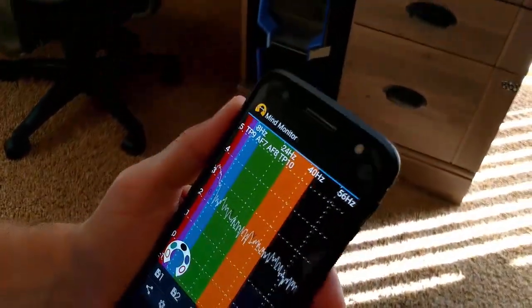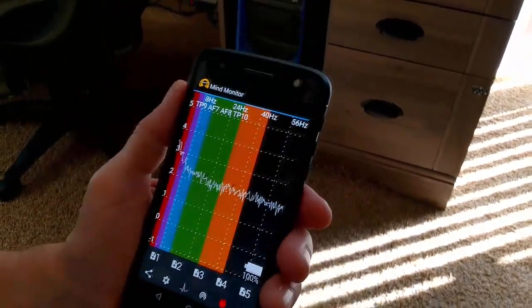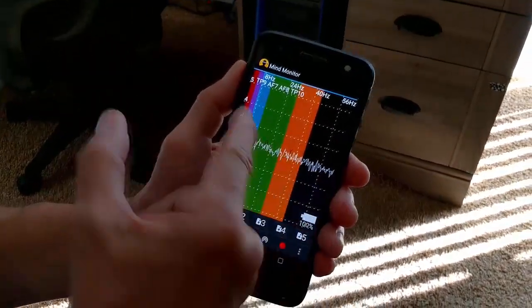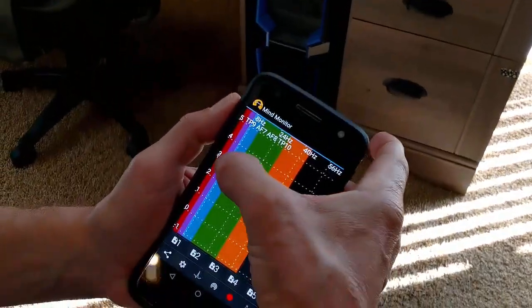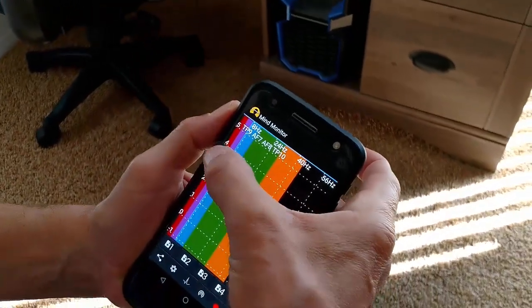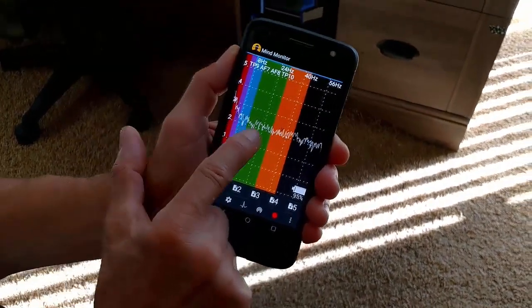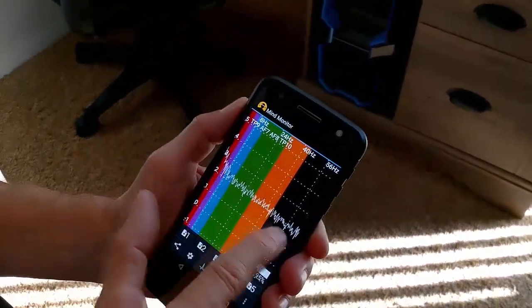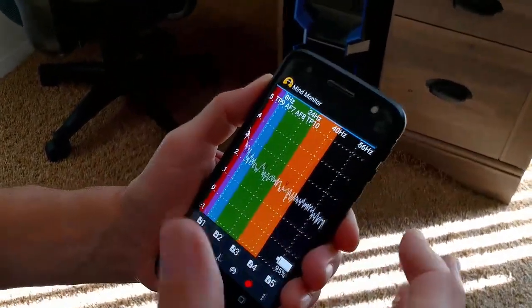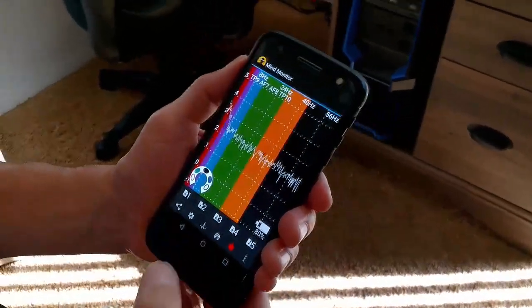Again, a little bit technical. I'll be explaining this further into the course, and also you'll be studying this as well. But this shows the relative spectrum here, where the theta and the delta are very high. And then as we drop down into the alpha and the gamma, we see that we have lower and lower total band energy, so to speak, or peak performance.